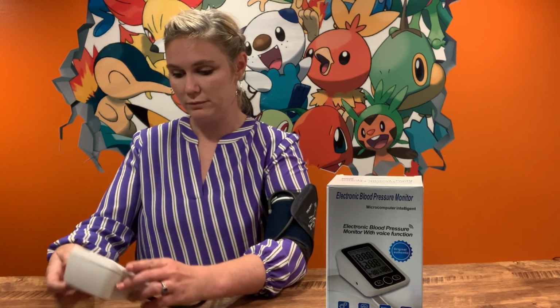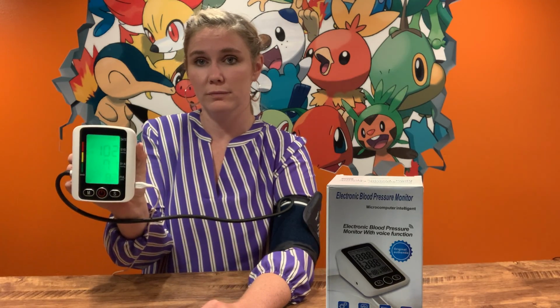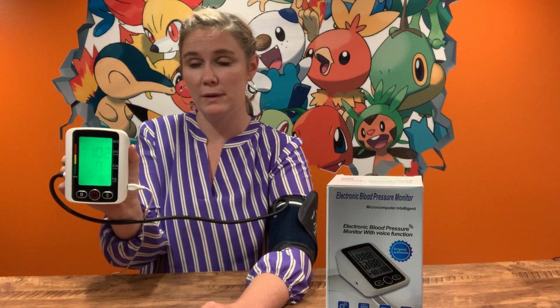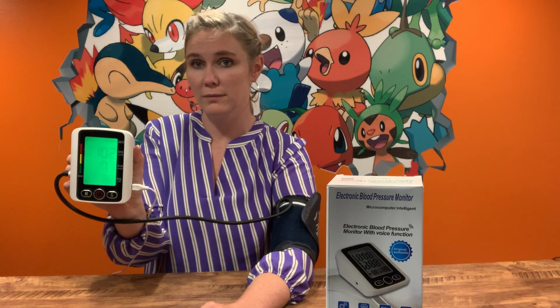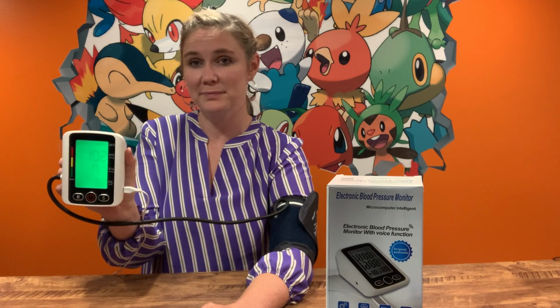It's starting to let the air out now. Your blood pressure is systolic 102 millimeter of mercury, diastolic 71 millimeter of mercury. Your pulse was 82. Your blood pressure is normal.